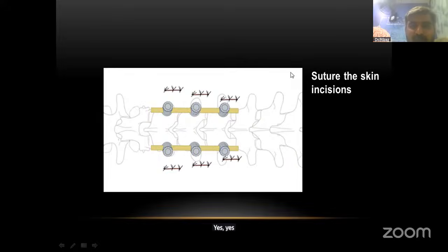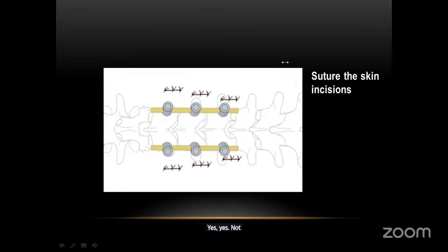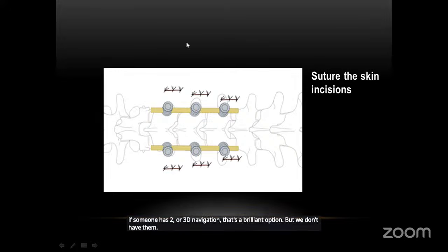Yes. If someone has 2D or 3D navigation, that's a brilliant option. But we don't have them. We operate on fluoroscopy. Yes.